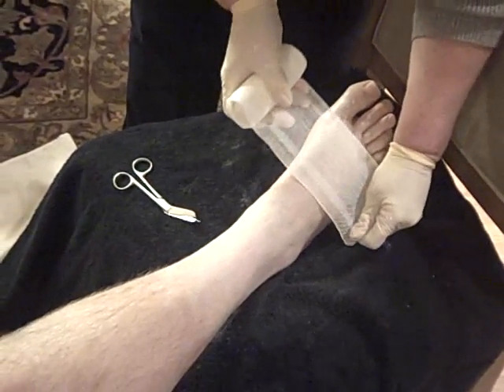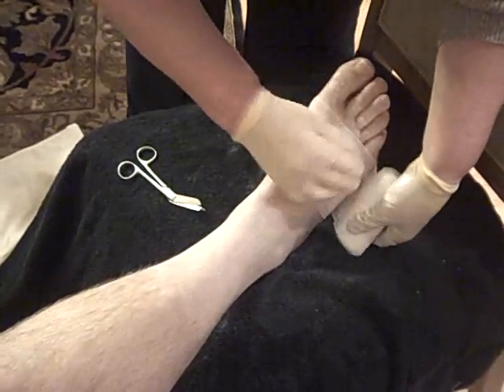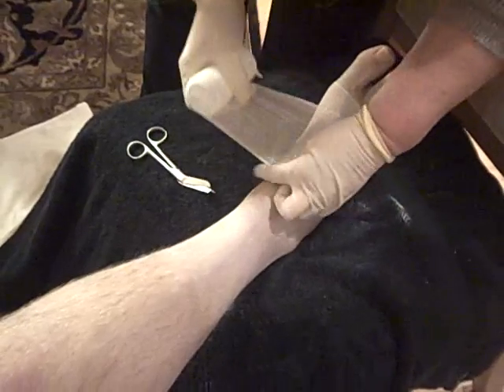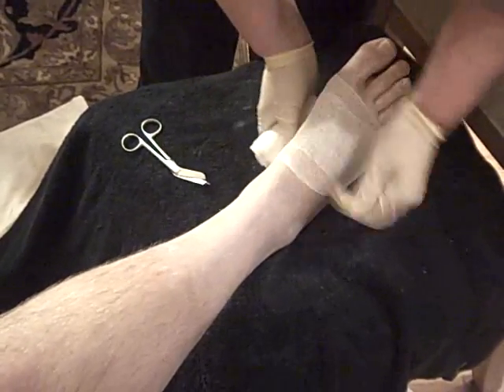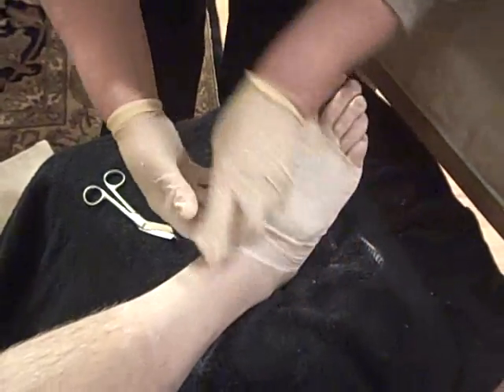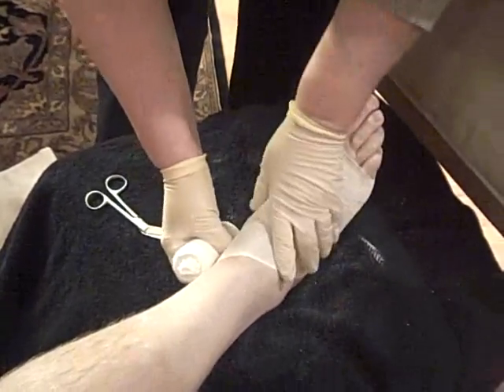Now we are going to apply an Unna Boot. She starts at the foot. An Unna Boot is going to help the patient establish better blood flow from the lower extremity back up out of the area where it needs to be.